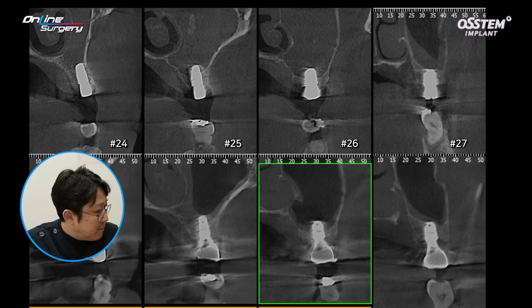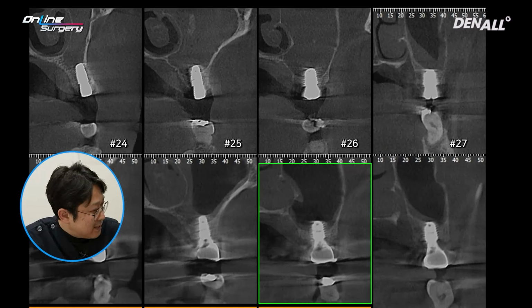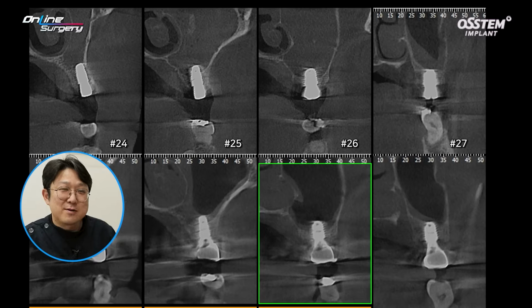This is a 7mm implant, and you can see that about half is in contact with the residual bone. It's between 3 to 4 millimeters. When load is applied on the implant, at around 4 or 5 millimeters, load is concentrated there. If you look at the references for successful sinus surgery, there is a difference in success rate using 5mm as a standard. If sinus augmentation of 1 to 2 millimeters could be possible, it could be successful. If we could regenerate 1 to 2 millimeters of bone more around this implant, I think this implant could be nicely maintained.